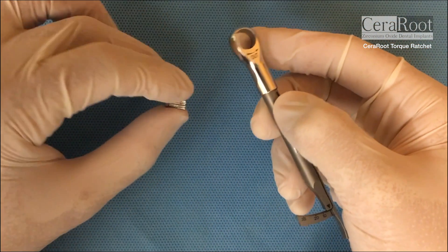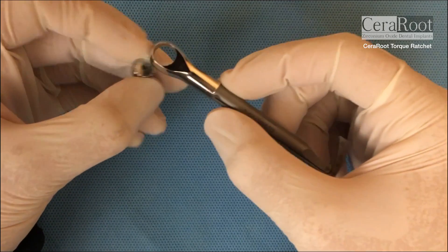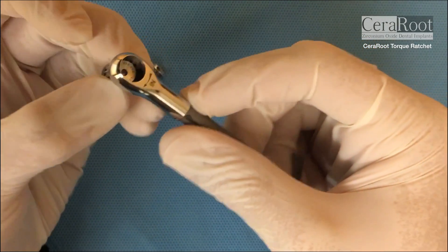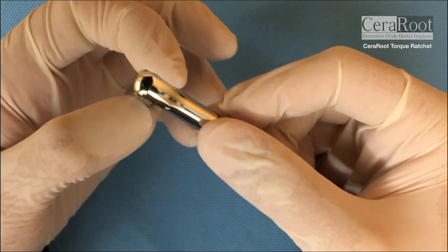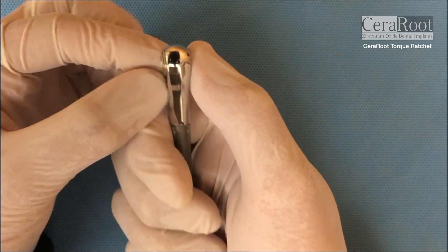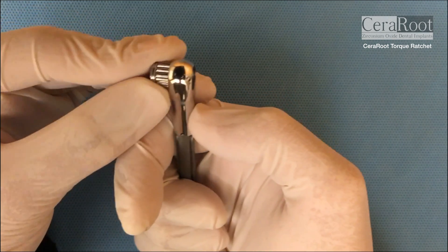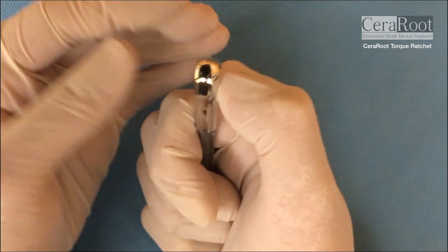If you want to use the short one and you want to screw the implant in, you're gonna bring the wheel from below until you hear a click so it doesn't move — it is stable. To remove the wheel you have to push down and it comes out. Again, in until you hear a click, and then to release, push down.